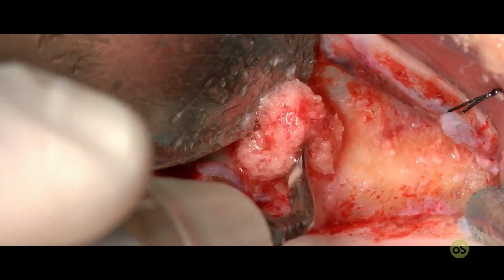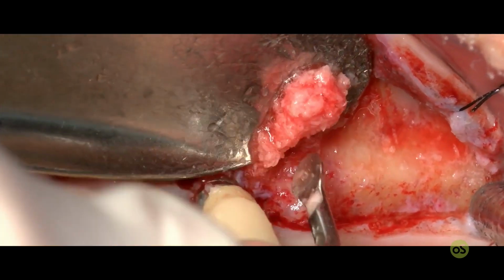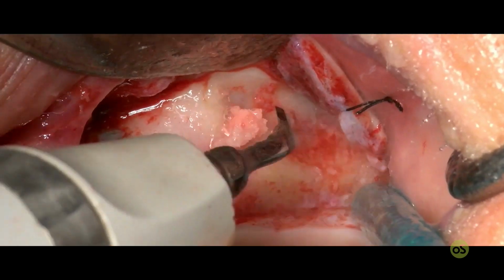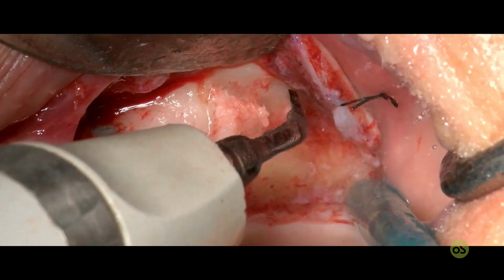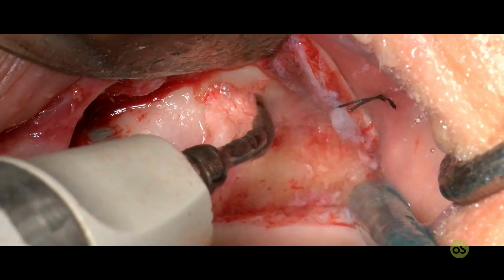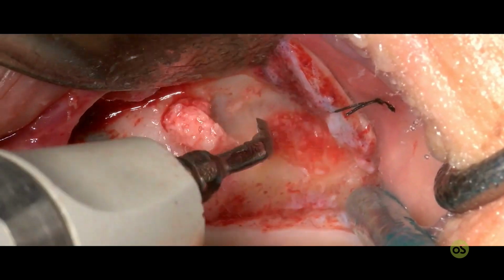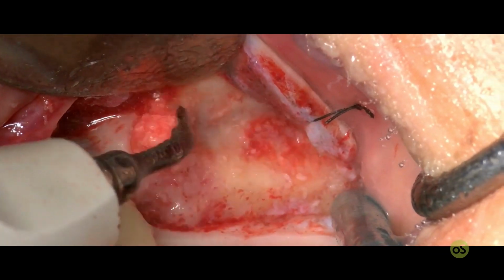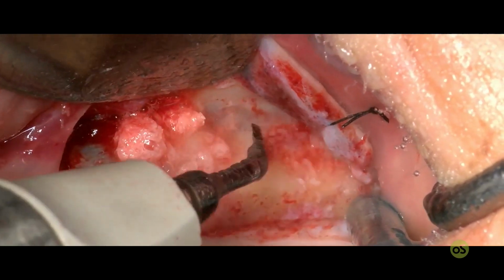For this reason, we collect the bone, and the best thing is to collect particles that are not too small. It's very important to combine the autogenous with the xenographic material, because we know that the autogenous particles have a lot of BMP proteins.